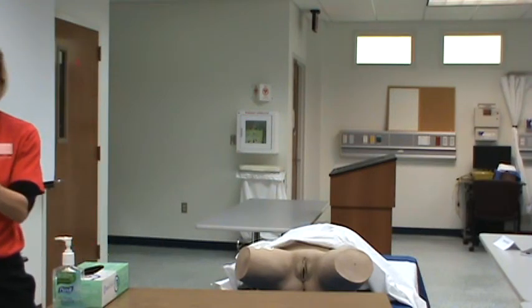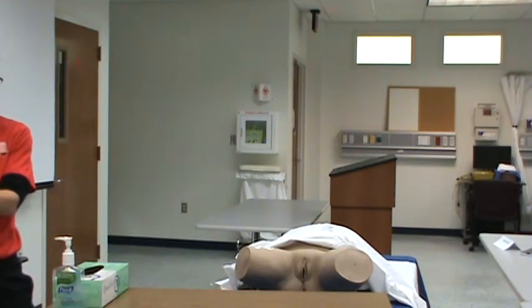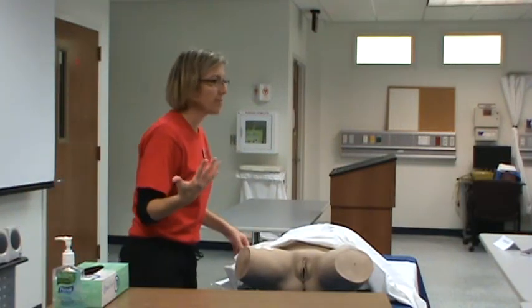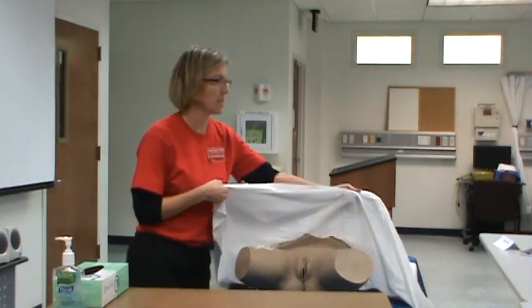And then if this is where you get rid of it in your facility, into the trash, great. If it goes in a different type of container, just know your facility policy. Cover her up.